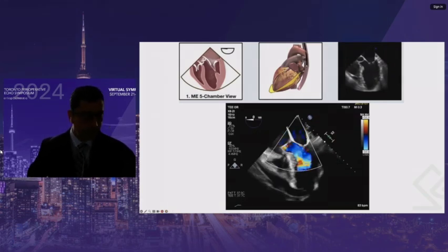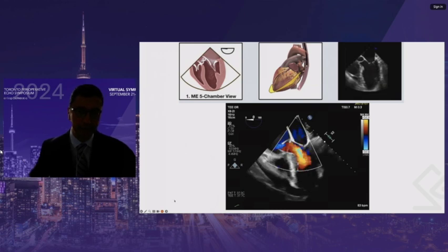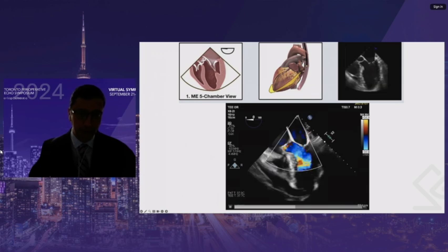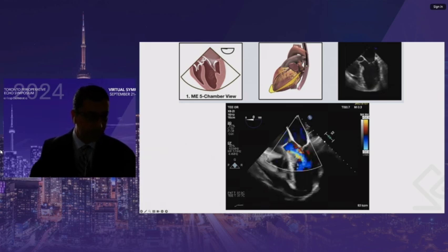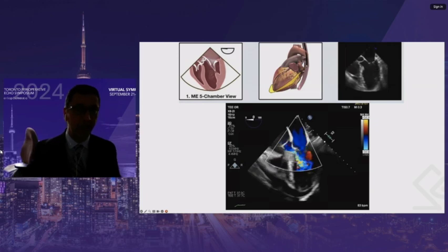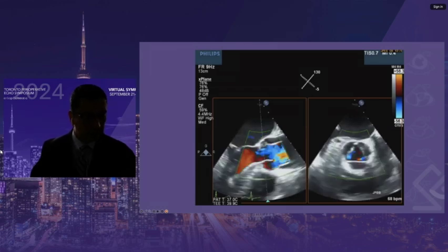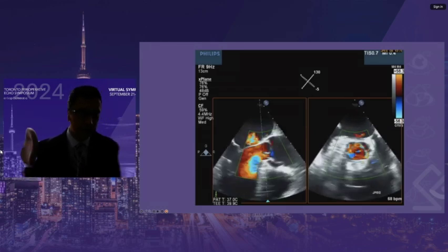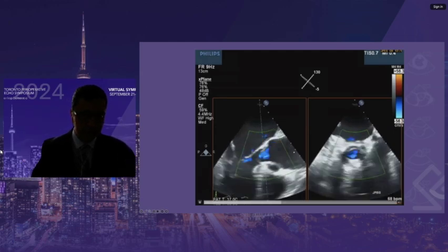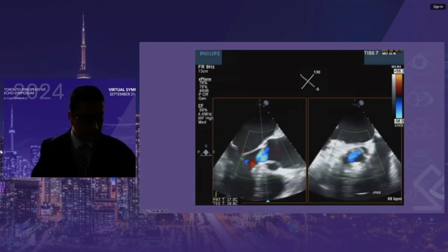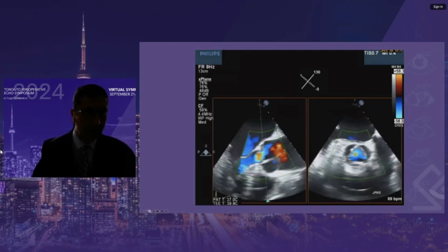This first image is taken from a patient with a type A aortic dissection. You can see the dissection flap in the aortic root; color flow Doppler is showing aortic valve regurgitation, there is a pericardial effusion, and the ventricle looks hyperdynamic — so in a single image we can see multiple diagnostic points. This orthogonal color flow Doppler of the aortic valve shows a type A aortic dissection with two flaps at the sinotubular junction, anterior and posterior, and the flap is actually protruding through the aortic valve, creating aortic valve regurgitation.